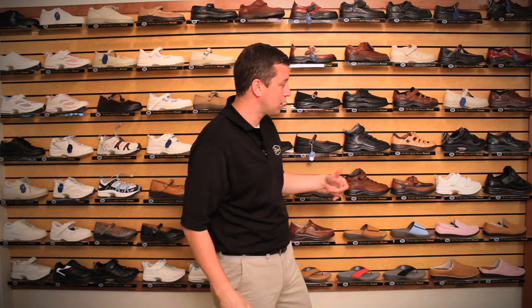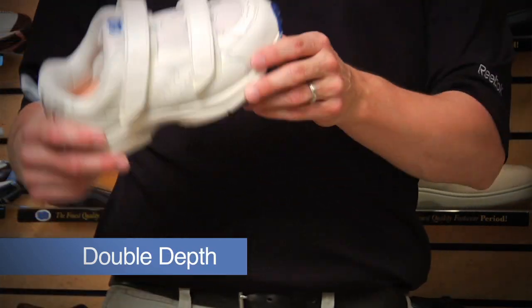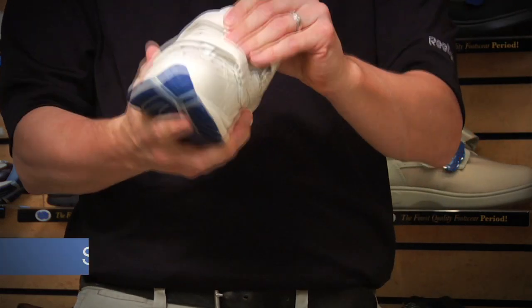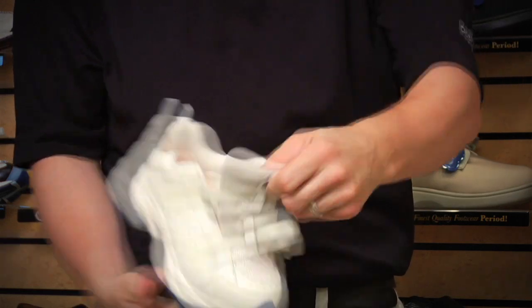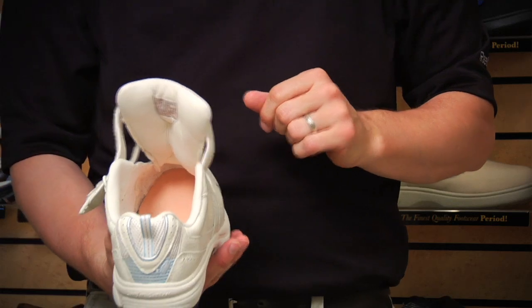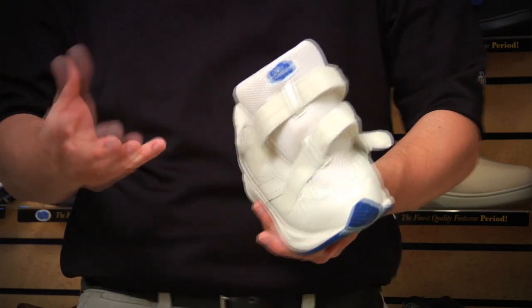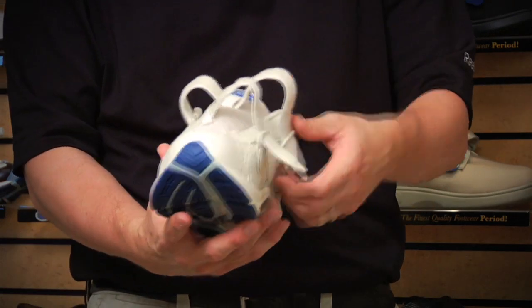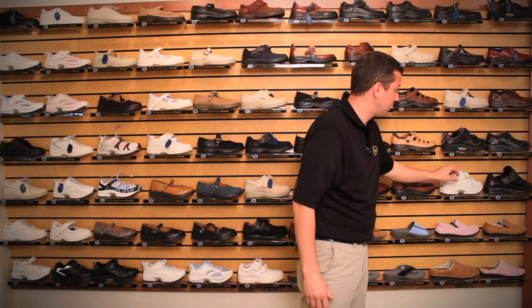Speaking of swelling, we also have a line of extra depth, or what we call our double depth line of shoes. This would be our Spirit Extra Depth. The Spirit Extra Depth is nice because it has a two-strap velcro that is able to accommodate and open up significantly more than any of our other styles of shoes. It's great for patients with significant deformities who may not want the Lycra option but still need that extra depth.